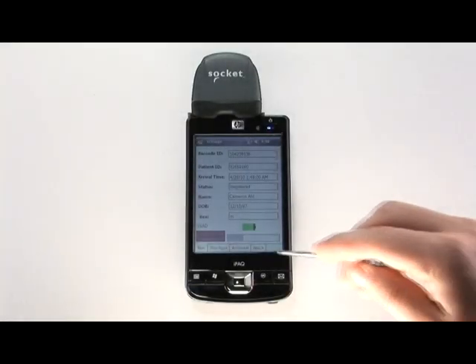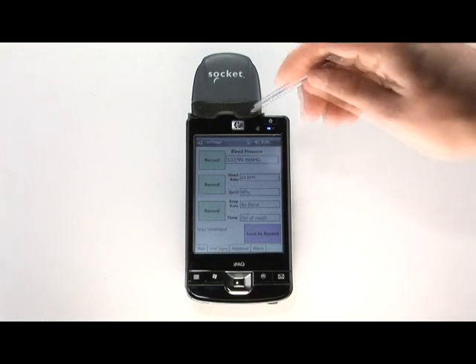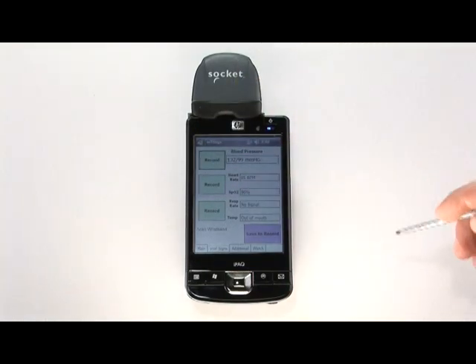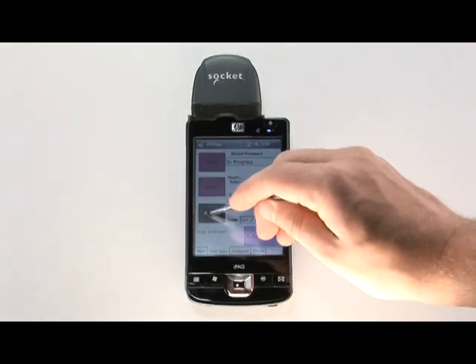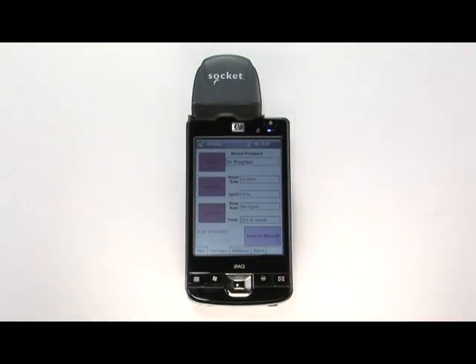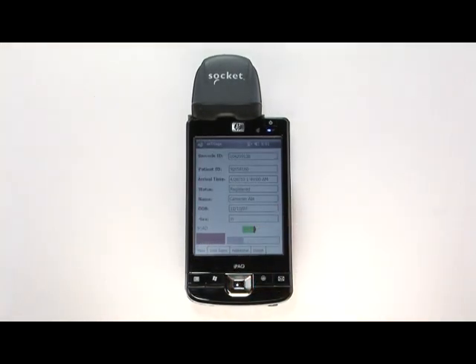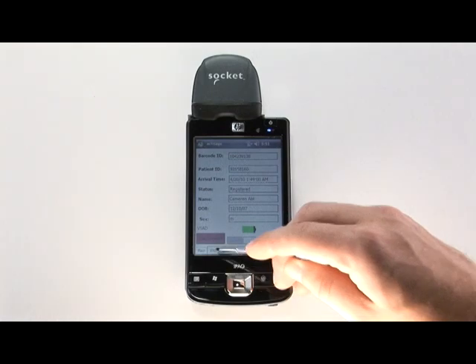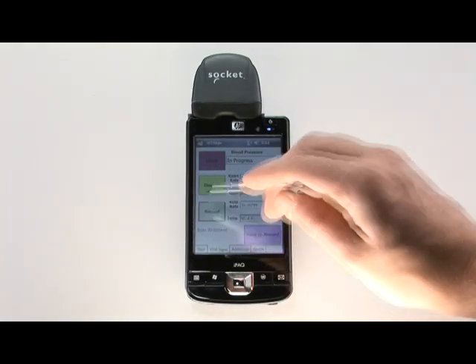The PDA displays the patient's vital signs in real time and automatically uploads the information to the EMR database. One of the advantages of the DTA over other vital sign monitors is its intuitive and multifunctional touch screen interface on the PDA. Battery status for the device is also displayed on the main page.